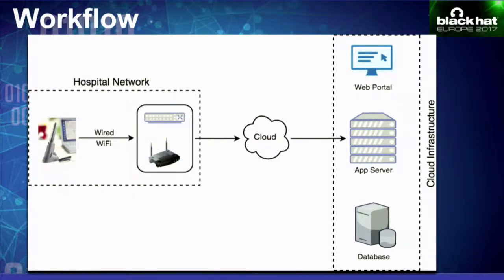They also expose a web portal, so your pharmacists, your doctors, even patients can log in. They all have their own accounts. And there's segregation of data there, so they can all log into the portal and gain access to their data.